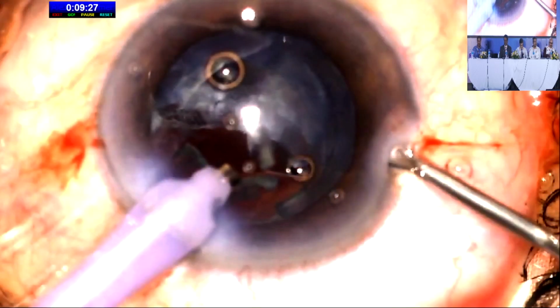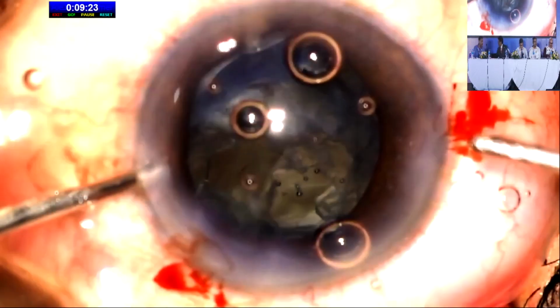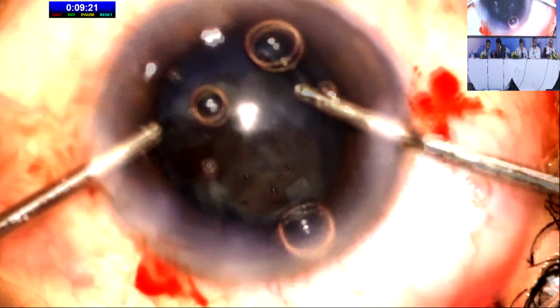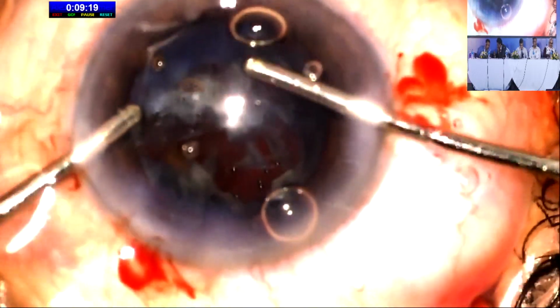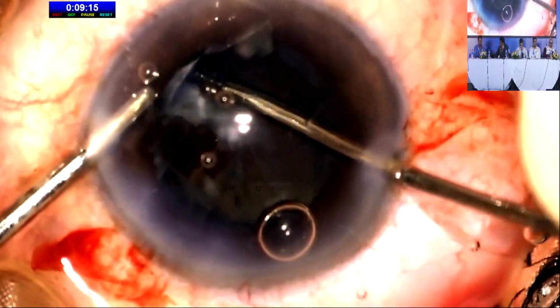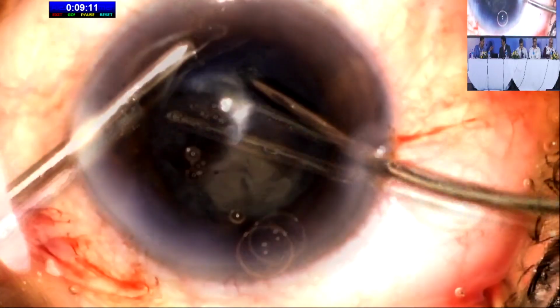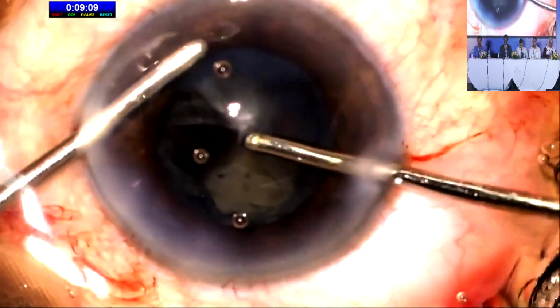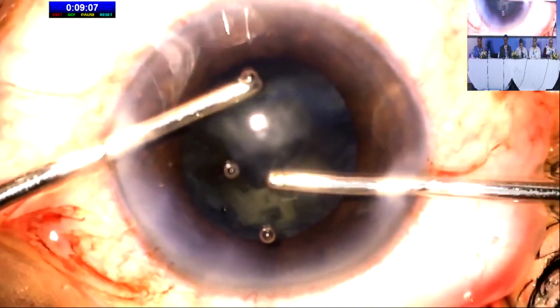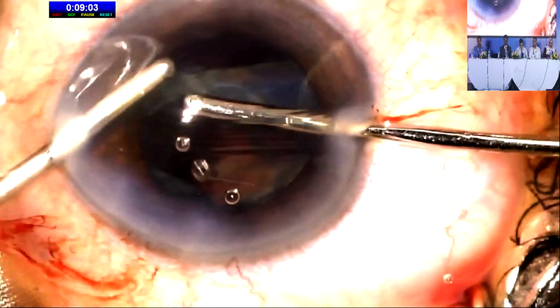Prior to withdrawing the phacoprobe, I first perform a viscofluid exchange. There seems to be no disturbance in the vitreous, so I attempt to remove the cortex with the bimanual irrigation aspiration. At any point during this step, should I find any vitreous disturbance, I would move to using a cutter to first cut the vitreous in the cut IA mode and then remove the cortex in the IA cut mode.